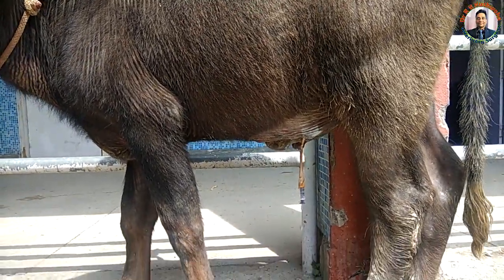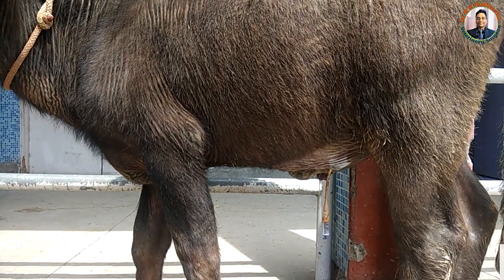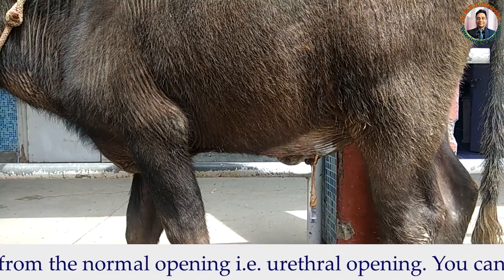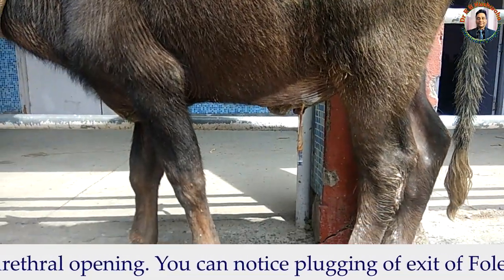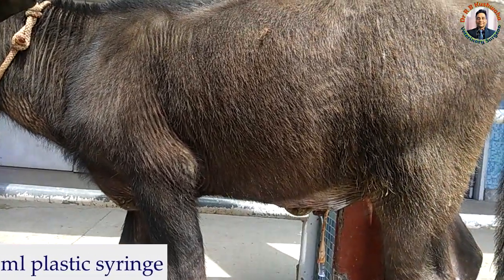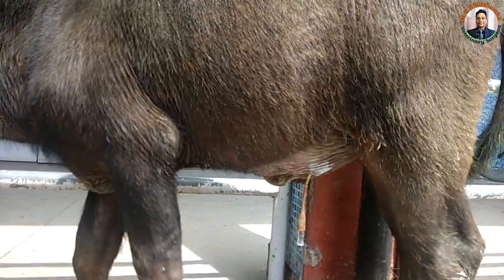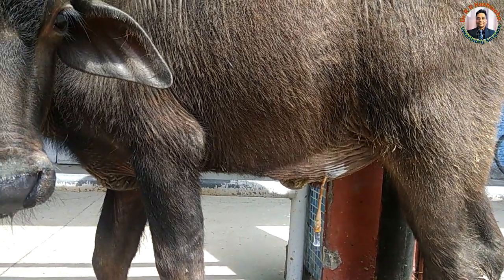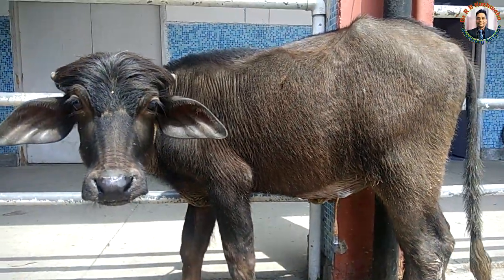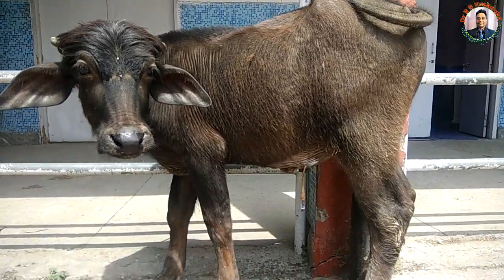This case presented after complete recovery from the obstruction. As you can see in this video, there is dribbling of urine from the normal opening — that is from the urethra. The exit of the Foley catheter was blocked by a 2 ml syringe. The owner told me that urine was coming freely from the normal opening for the last three days after plugging the exit of the Foley catheter. This means the calculi present in the urethra were totally dislodged by the flow of urine.